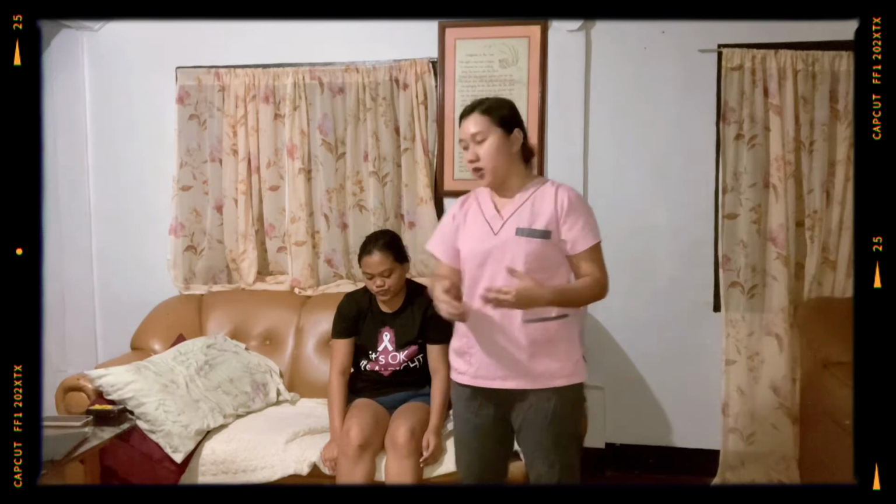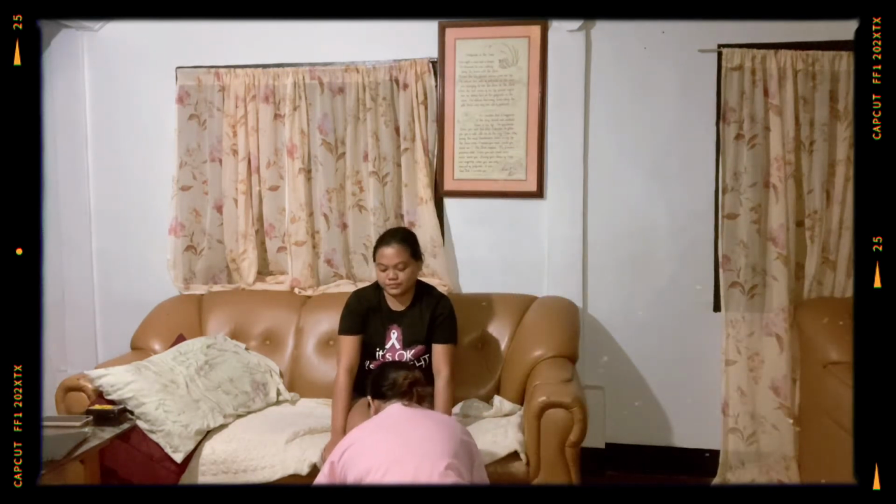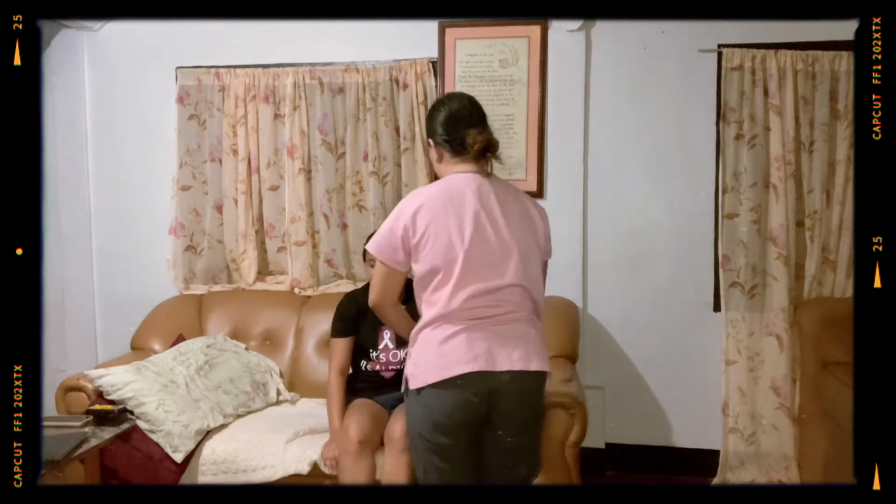So note that if dizziness occurs, immediately stop the procedure. For procedure number 7, assist the patient to put on footwear and robe if desired. This is to ensure safety and warmth. So ma'am, I'm going to put your footwear. Magamit ka robe, ma'am. So dili na no.